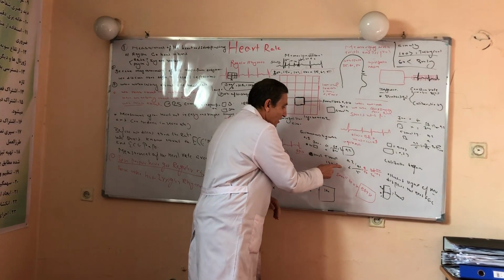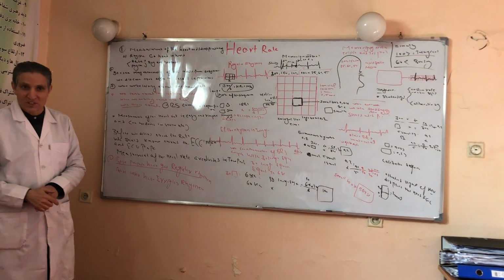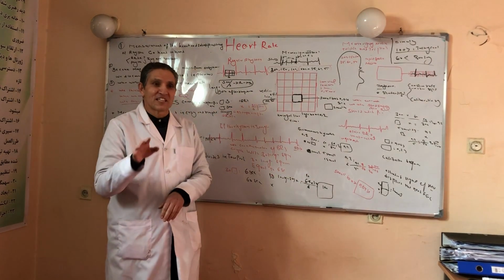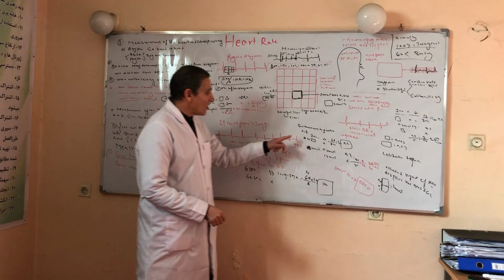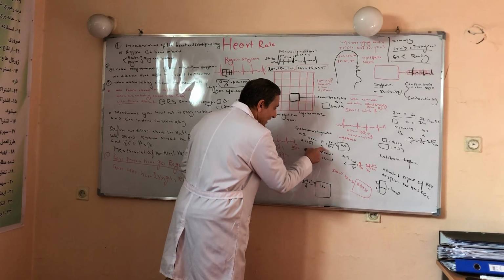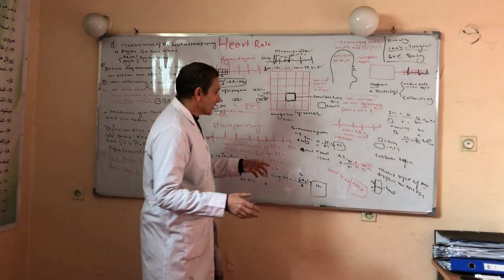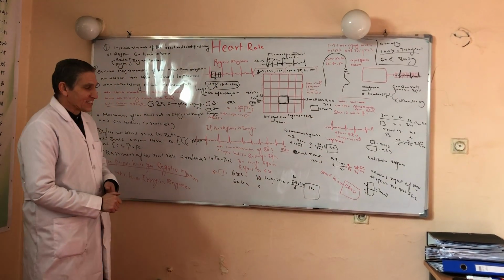It takes 0.04 seconds. What is the mechanism by which 0.2 and 0.04 are produced? It is very easy. As we know, 300 large squares move under the needle of the ECG machine within 60 seconds.